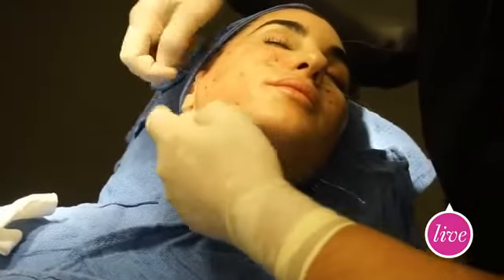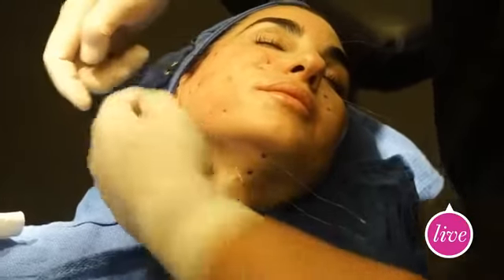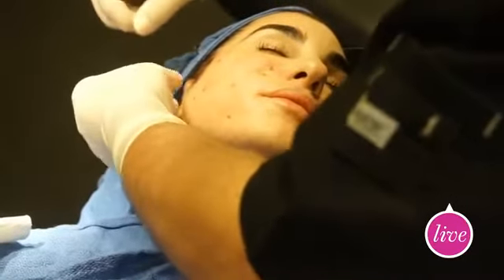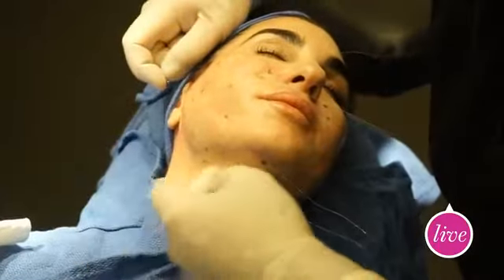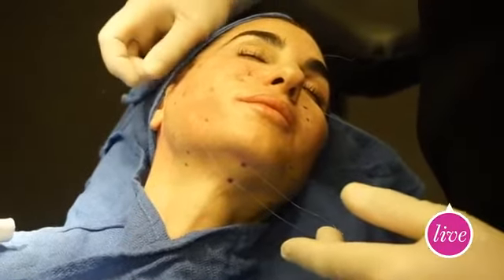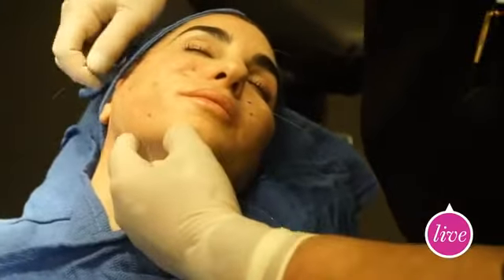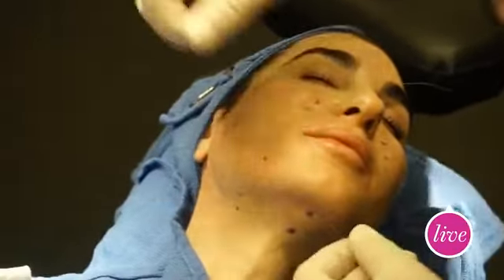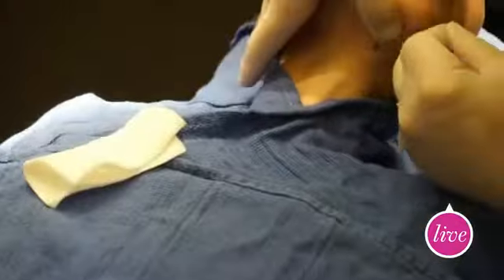Now, speaking of that, is this something that a derm and a plastic surgeon can do, or only a plastic surgeon? No, dermatologists, they can do it as well? Facial plastics, absolutely. And what you just saw, I just locked it even more in place, and you can see the effect on the jowl. Oh, wow. Right? So now we're just going to do the neck. Again, holding on and advancing all of the tissue.